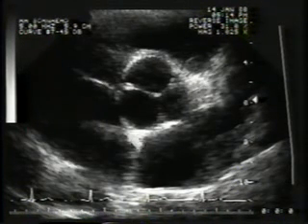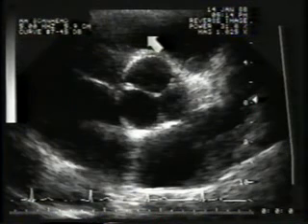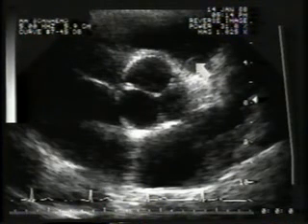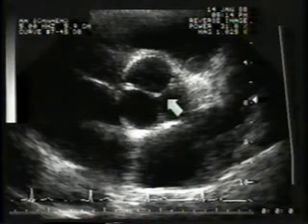The right ventricular outflow tract curves anteriorly around the aorta, and here is one of the pulmonary valve cusps. A short segment of the main pulmonary artery can be seen beyond the valve. In this diastolic frame, the closed aortic cusps form a Y within the aorta.